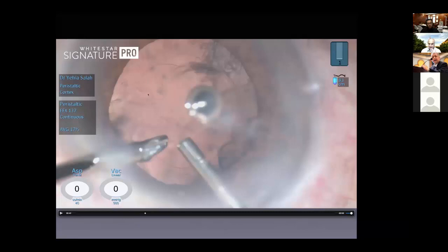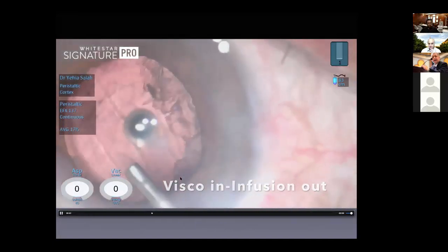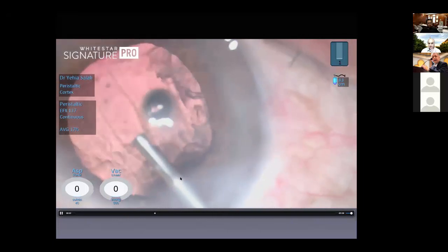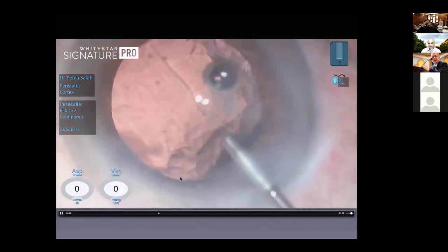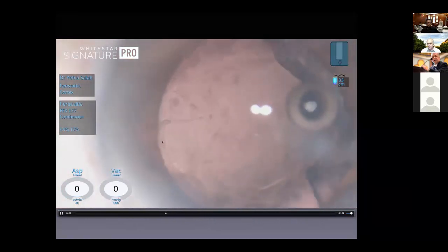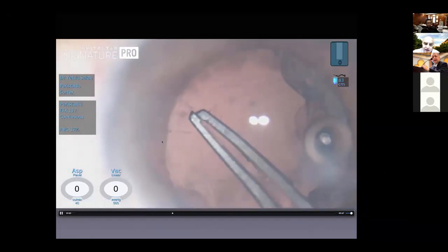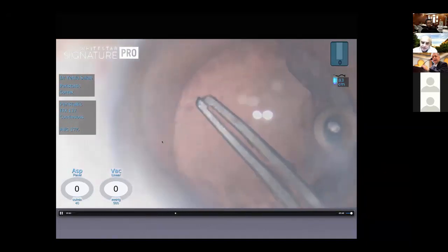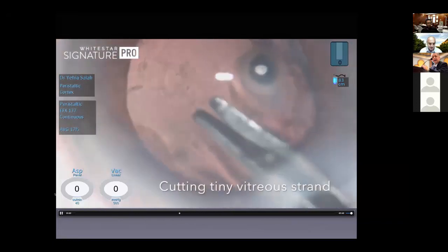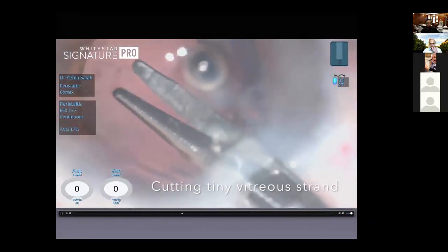You can see the tear here is an ellipse. You can see the edges of the tear. Viscoelastic in, irrigation out, making sure to tamponade the tear and tamponade the anterior vitreous face, focusing on the tear. And now, after evaluation, the tear, the decision here, you can have different decisions.